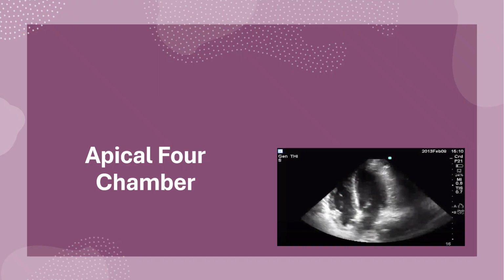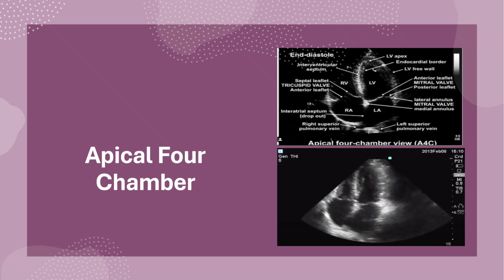Let's keep discussing apical four-chamber view. On the top right, you see a frozen image with delineated anatomy. On the bottom right, you see an image and a video clip of our apical four-chamber view. In this view, you see the septal wall of the left ventricle, lateral wall of the left ventricle, tricuspid and mitral valves, right ventricle, and both left and right atria.